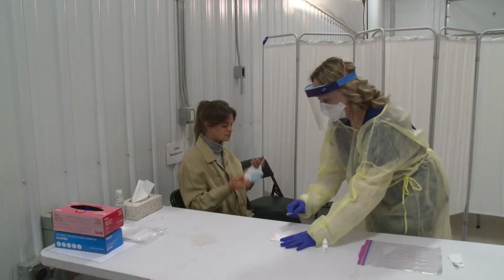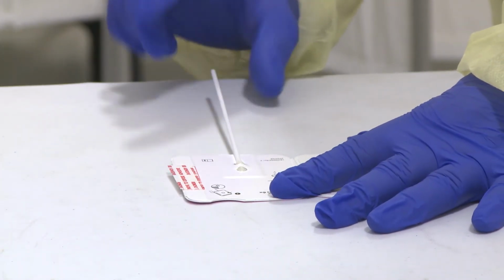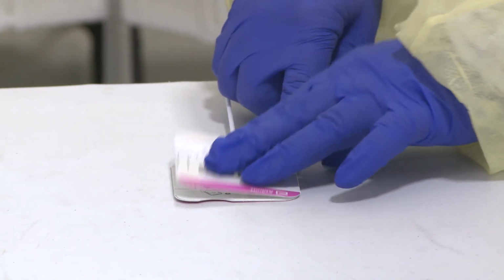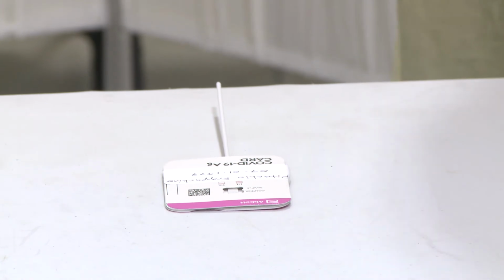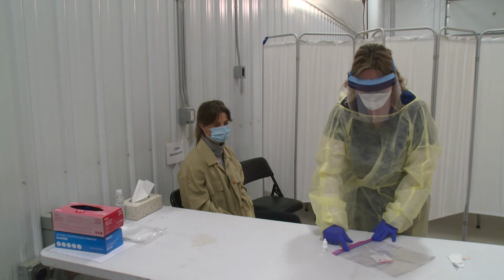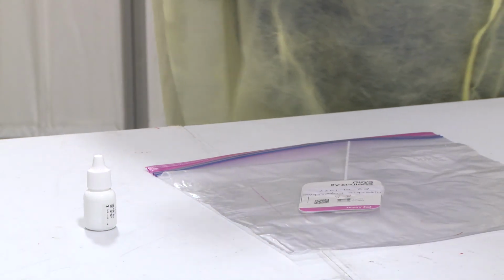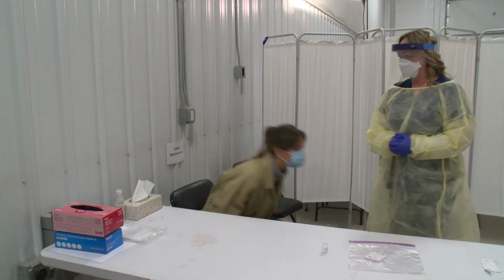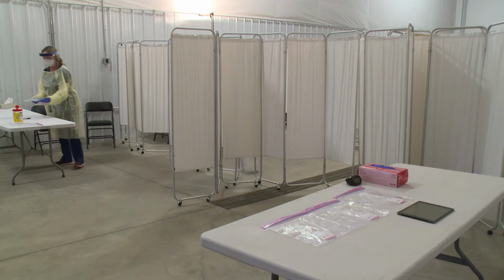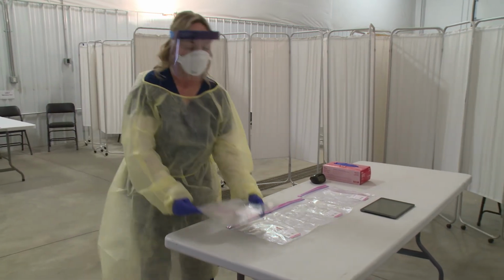They would then insert the swab into the larger bottom hole of the Binax card, pushing it towards the top of the card until it's visible in the smaller hole, rotating it clockwise 3 times, leaving the swab within the card, remove the adhesive protector, seal the card up, write the time of collection on the label, and then place that card carefully within a Ziploc bag, ensuring that it's remaining flat at all times. The test should then be carefully removed to a resulting table. As you're moving that card, ensure that it is remaining flat at all times.